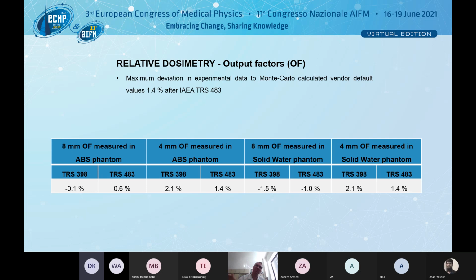You have to follow step by step a very particular procedure, how you scan films, be careful that they don't get damaged, do subtraction of background, and so on. It's a lot of parameters, but we also did measurement on gamma knife with films years ago, and it could be used. I'm just trying to emphasize that sometimes the hospital will not buy you a new detector, but if you have films, you can measure with films. Possible.